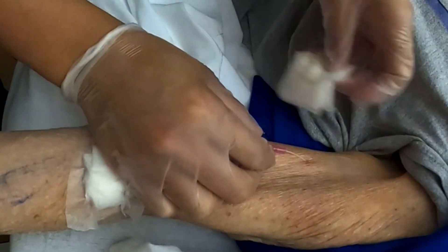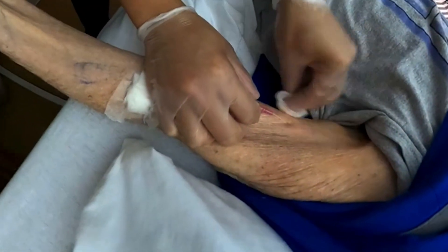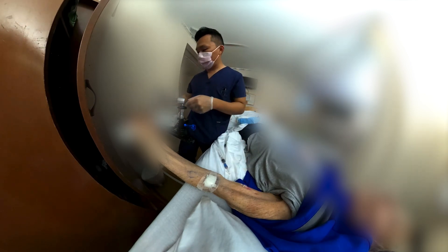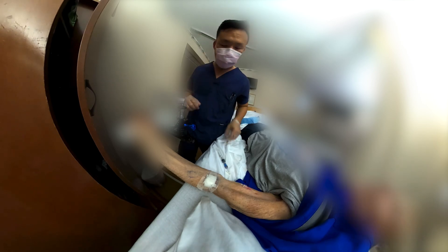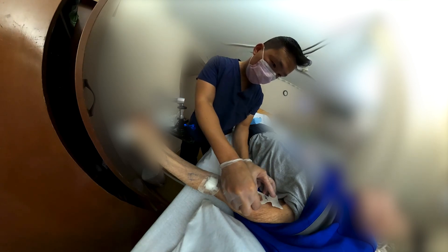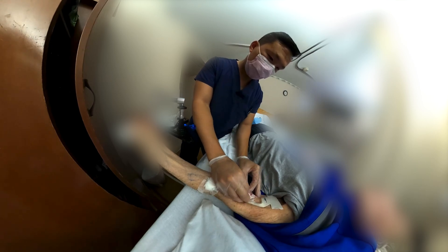Rather than sticking him again — because it's already working — I'm going to hope for the best. What I probably should have done, thinking back on what I'd like to do better next time, is more threading. I should have threaded the needle in more and shouldn't have been so confident. But hindsight is 20-20. This is another good reason why you want to thread the entire needle during the insertion process, so you don't come across this kind of problem.